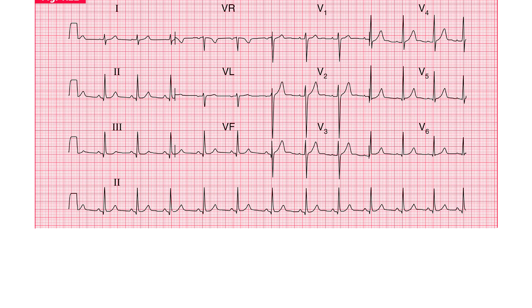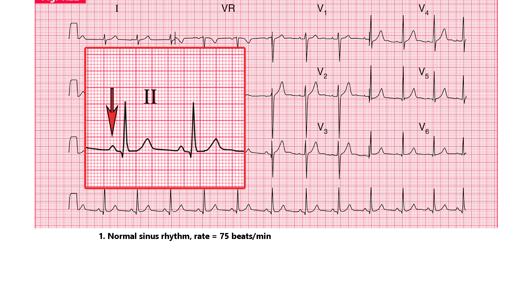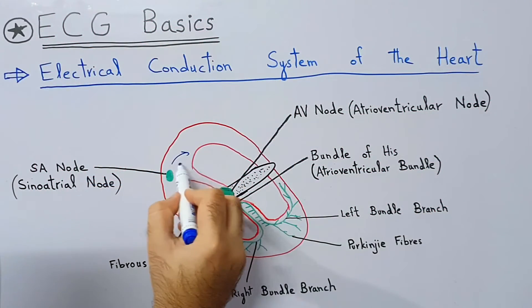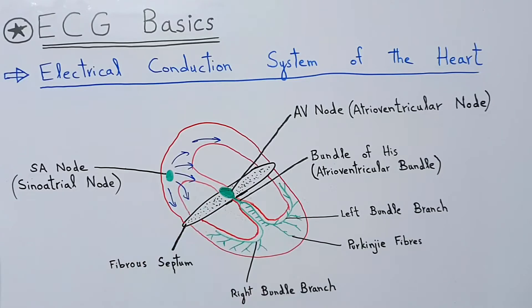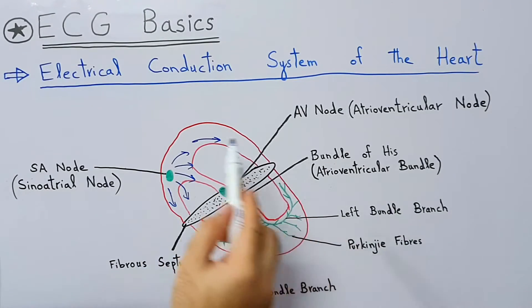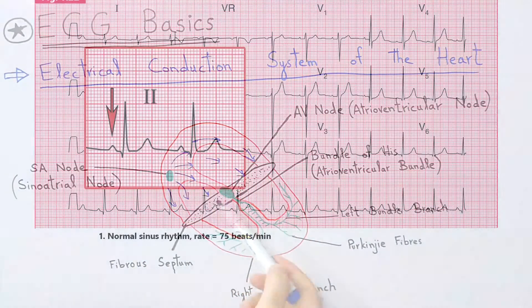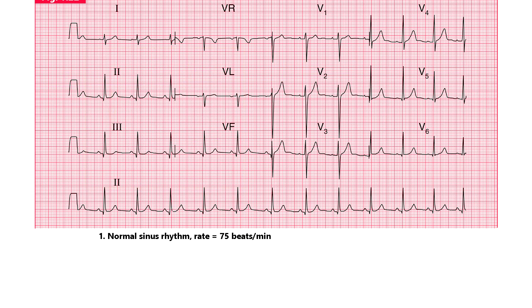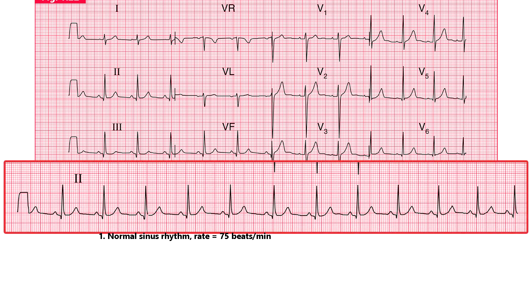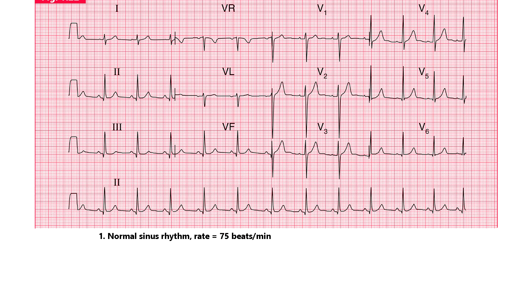This is a normal ECG. Let's report it. We will write down point number 1 as normal sinus rhythm, rate equal to 75 beats per minute. Sinus rhythm means that P waves are present before QRS complexes. P waves are formed when the sinus node initiates an electrical signal that spreads into the atria, meaning the sinus node is controlling the heart rate. Note that QRS complexes are equally spaced in the bottom rhythm strip, which shows that the rhythm is regular.